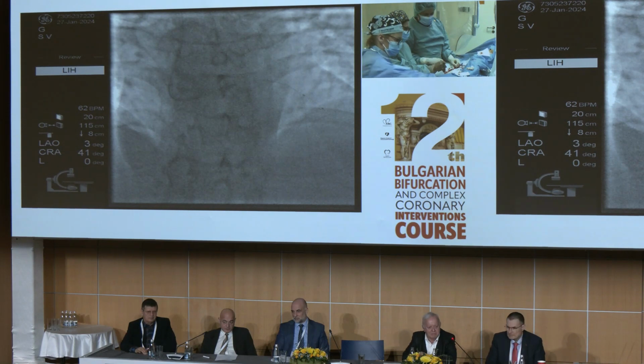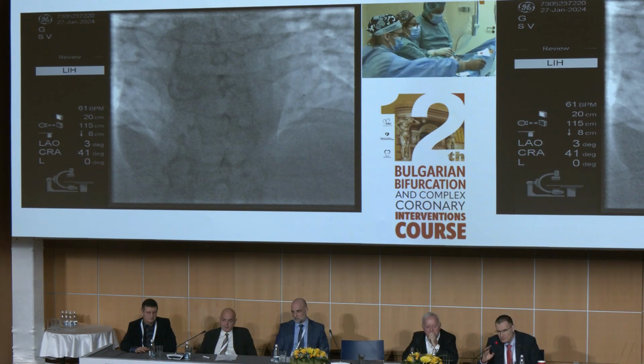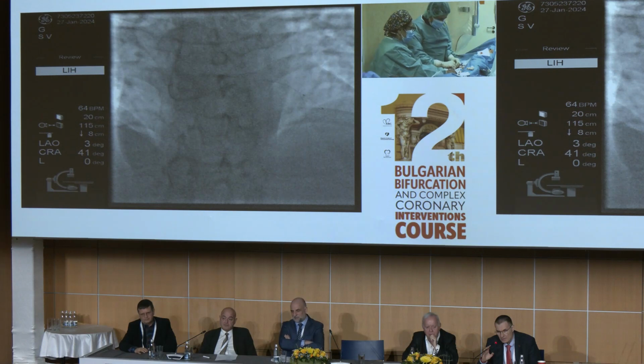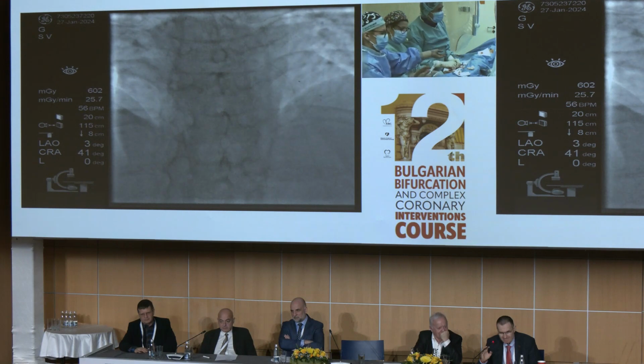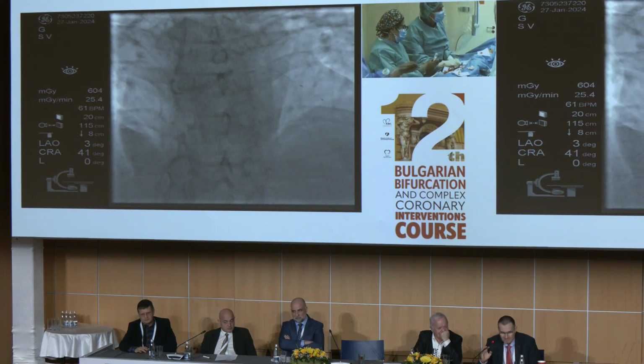Then at the side branch we will inflate just. What is the size of the balloons for kissing? Actually, we are going to make the most of our IVUS guidance to do a novel technique that you invented yourself, and you named POCI, which is a combination of pot and kissing.